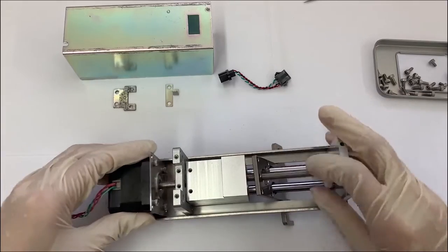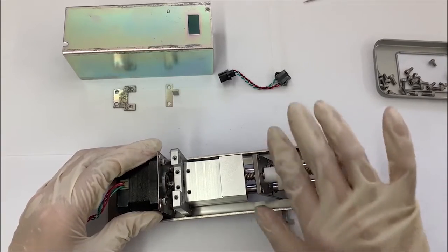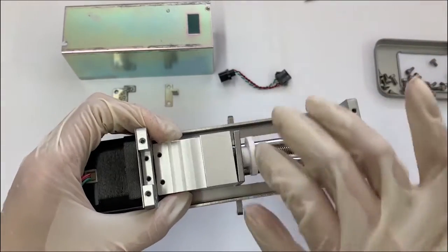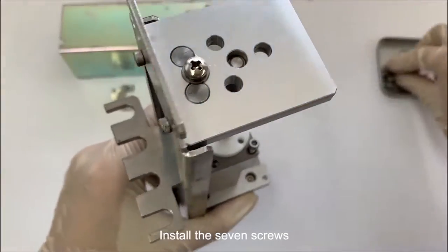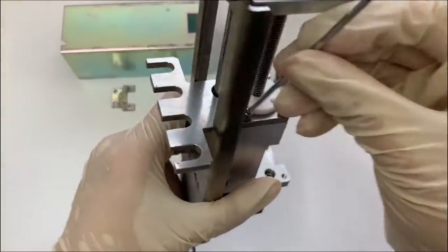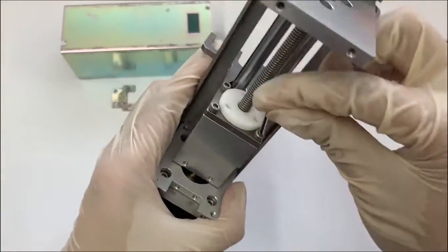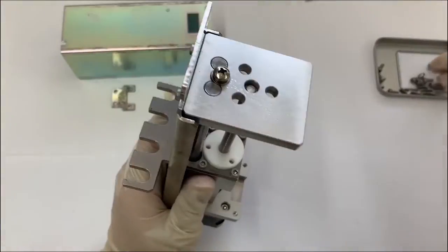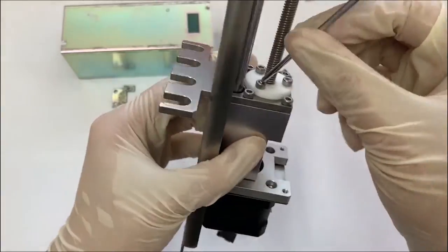Assemble the white plunger. Install the 7 screws.